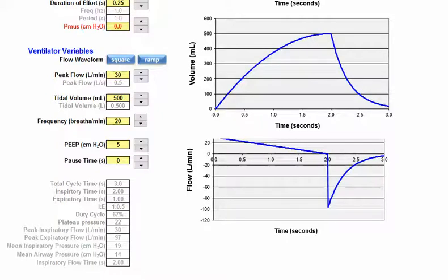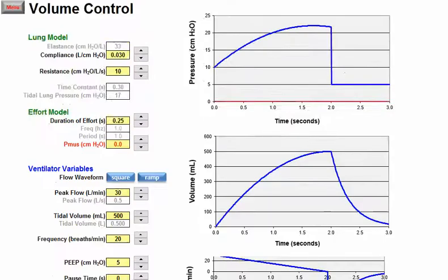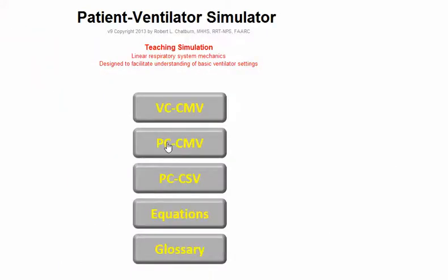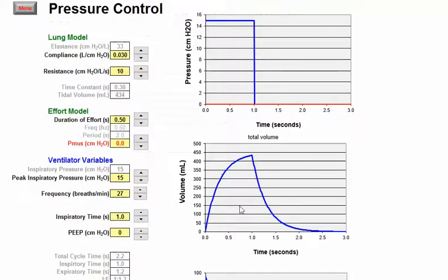But to get that decelerating flow in, it's going to take a longer amount of time. Now I'm at two seconds. And let's go to pressure control ventilation. And as you notice also with my pressure control I have the opportunity to set my inspiratory effort also. So this shows some of the new functionality of the simulator.